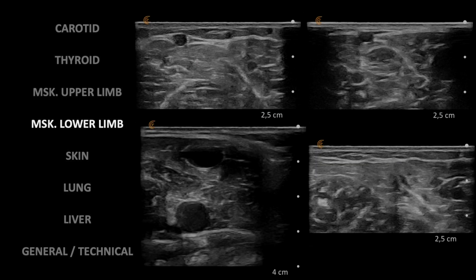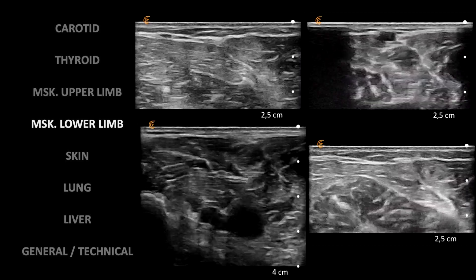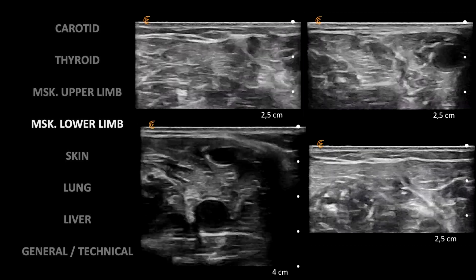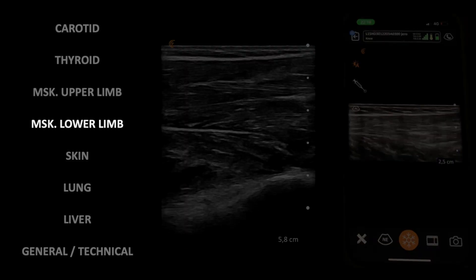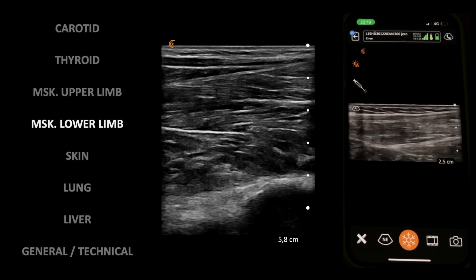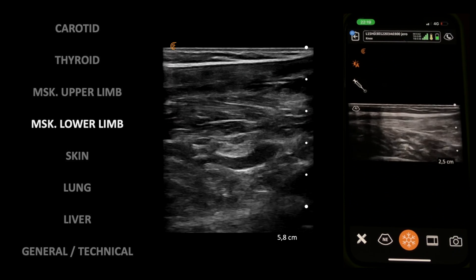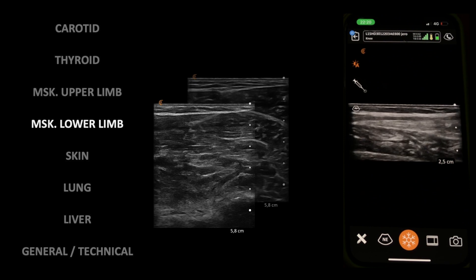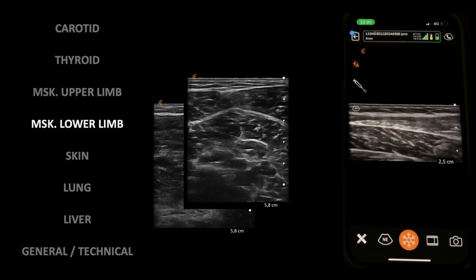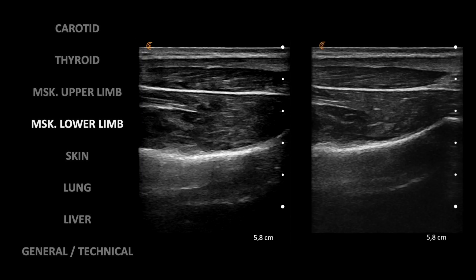One of the most useful things to do in the lower limb is to screen for deep vein thrombosis by compressing the veins gently with the probe, as shown here — if the vein collapses, there is no thrombus inside. Here I wanted to highlight the good image quality of B-mode to assess muscle injuries. Note the muscle fiber depiction and the quite high frame rate. These clips were recorded with the auto gain feature, which adjusts the gain by itself in real time to optimize the image. Same here with the soleus and gastrocnemius muscles at the Achilles tendon level.